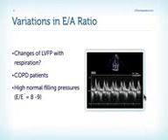This can be found particularly often in patients who have chronic obstructive lung disease, and it seems to suggest that these patients have high normal filling pressures with E to E prime ratio somewhere in the range of 8 to 9, maybe even more.